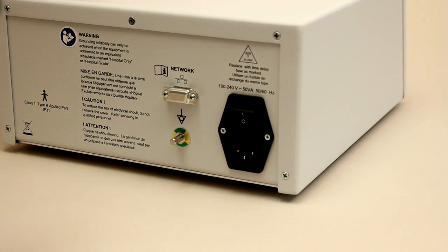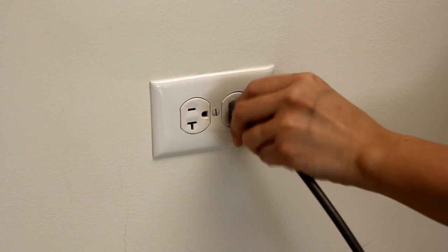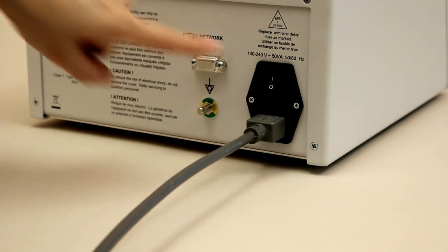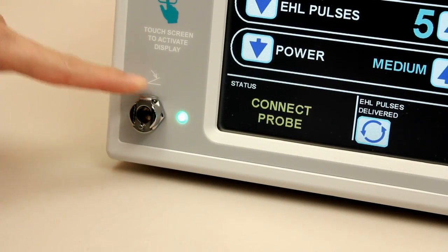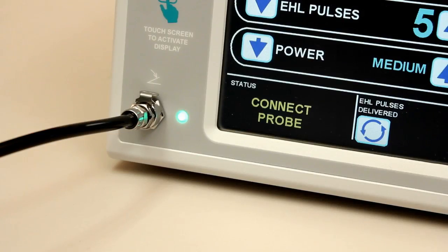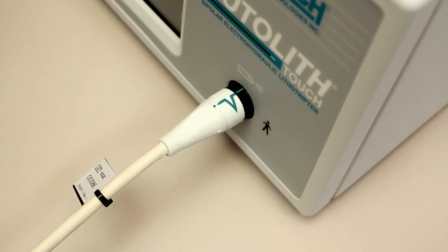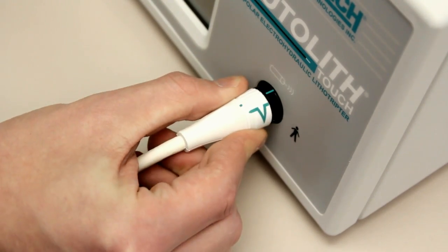To get started, attach the removable power cord to the rear of the generator unit. Connect the opposite end to a properly grounded electrical outlet, then turn on the main power switch. Now connect the pneumatic foot pedal to the front panel by pressing down the small flange located at the top of the connector. Depress the flange to release the cable. Attach the extender cable by simply lining up the green lines and pushing onto the connector marked probe. To remove the extender cable, turn the collar in the direction of the green arrow and pull.